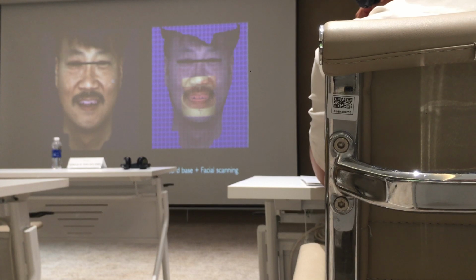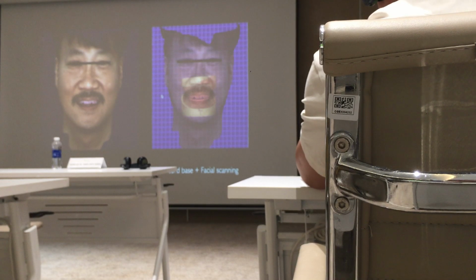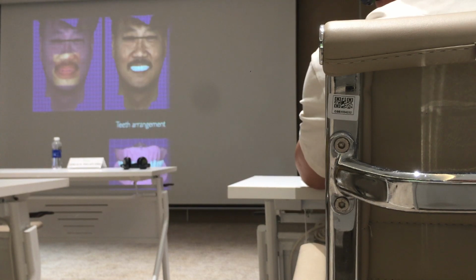So the patient got a facial scan with the wax ring. You can see the T markers here. And we did the desktop scan of the recording base, and we also have a T marker. So we use these T markers as a reference point. And because we use T markers, the merging process was very accurate. So from here, we could arrange our new set of teeth.